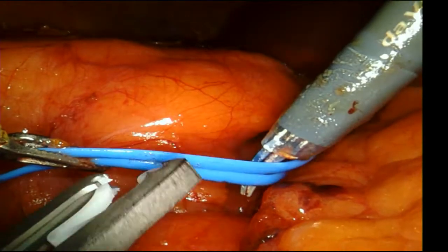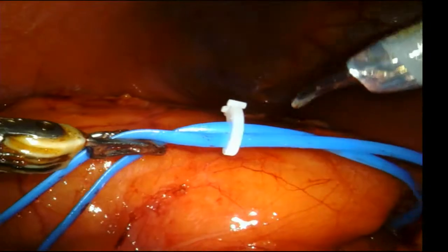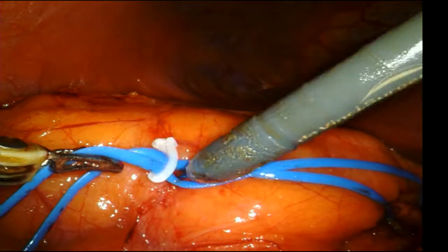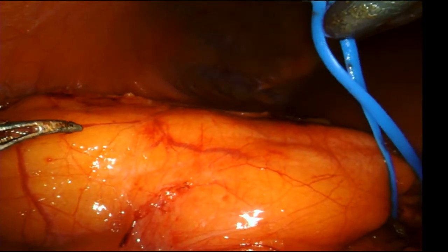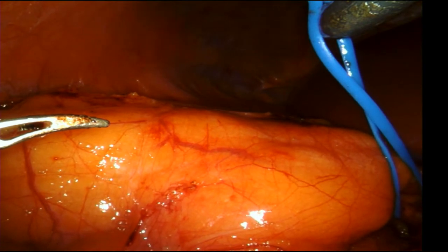How about you, Dr. Lau? You clamp the vein also, or? I only do the vein for complex partials, very deep partials. But I'm artery only. Mm-hmm. I usually do 2 clamps. I don't know, just voodoo. Yeah. But I feel like just make sure it has good closure.